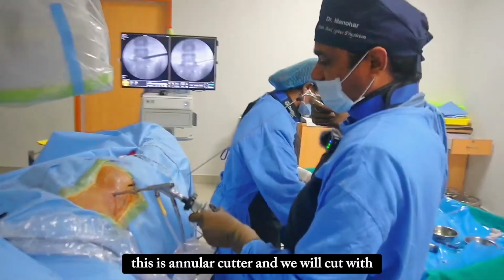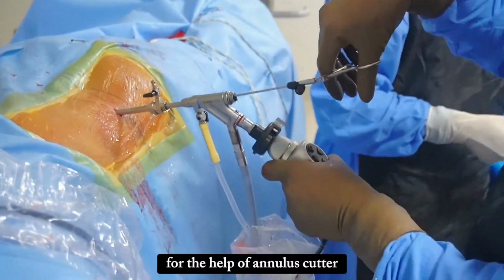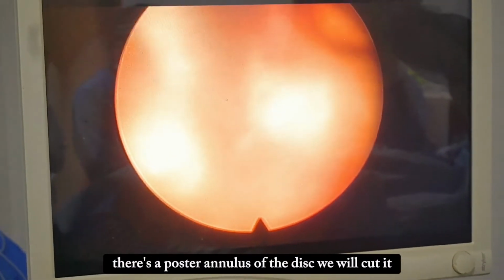This is the annulus cutter, and we will cut with the help of the annulus cutter. There is a posterior annulus of the disc. We will cut it.